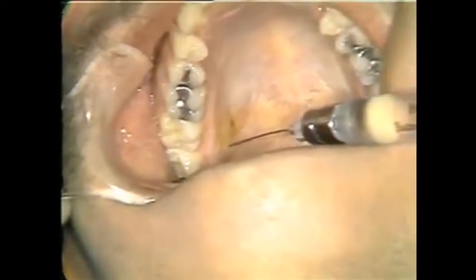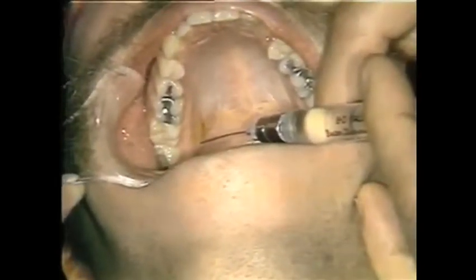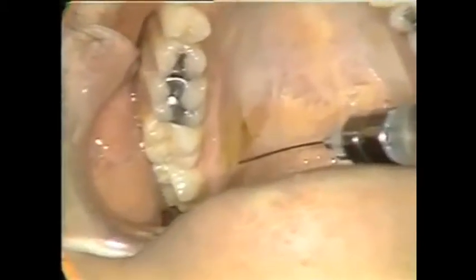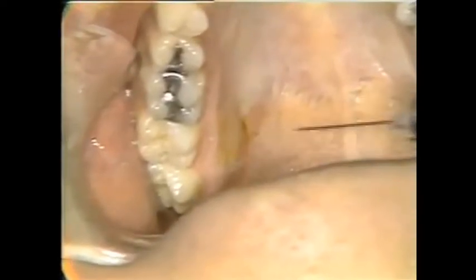And we make our puncture and carry our needle bevel clear to bone. Then we aspirate, and again in the usual fashion. And then we expel a few drops, up to a quarter of a cc if you can. And I can see those tissues blanching a little bit. I don't know whether you can see it or not, but we are getting some solution out into the tissues, and we know that we have accomplished our mission, and then out quickly.